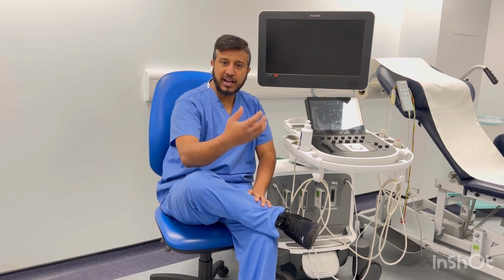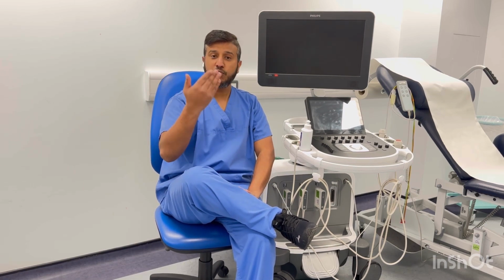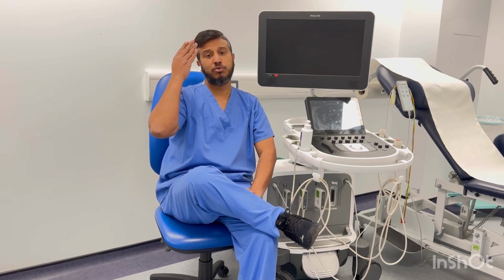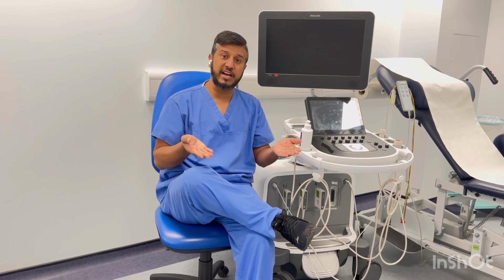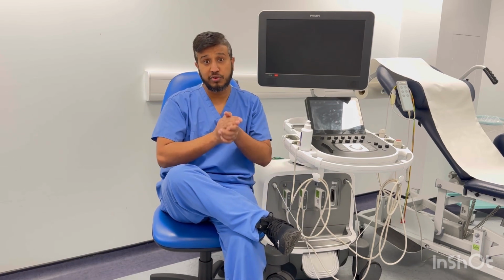So if you are targeting higher penetration in a patient, you will use a lower frequency probe, and if you are targeting lower penetration, you are going to use a higher frequency probe. They are opposite to each other. As your frequency goes up, your penetration goes down. So you need to keep that in mind.